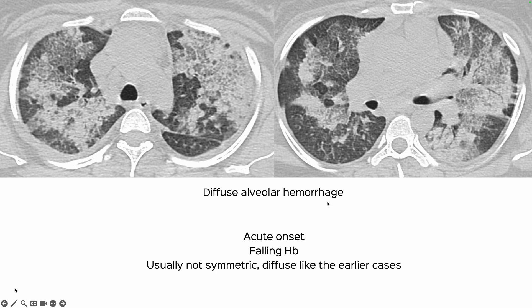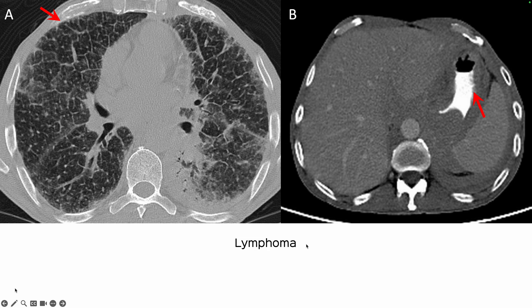This is a patient with diffuse alveolar hemorrhage. While there is crazy paving, we also see consolidation because of the blood, and there is subpleural sparing — so it's not as diffuse as the classic alveolar proteinosis appearance. Nevertheless, with acute onset and a falling hemoglobin, you would be able to make the diagnosis.